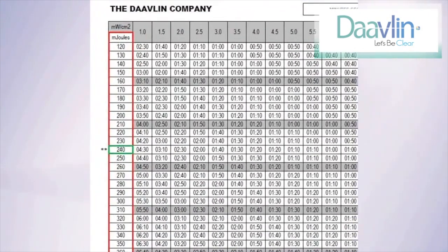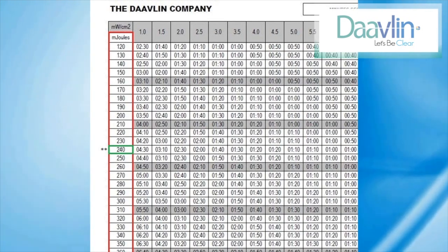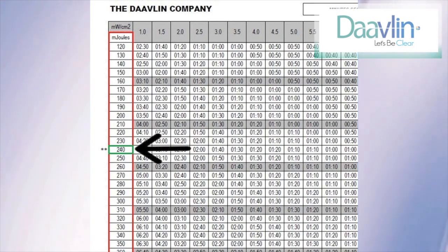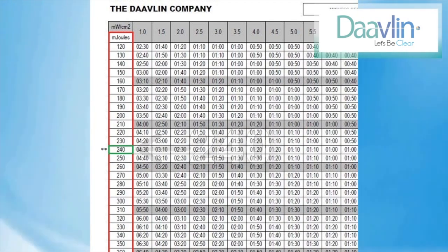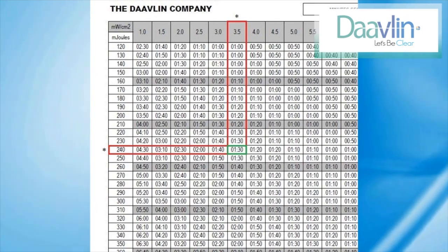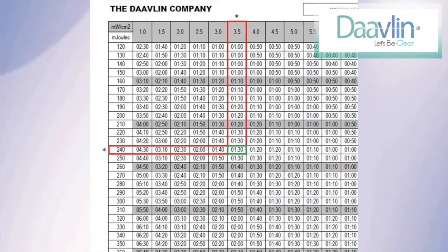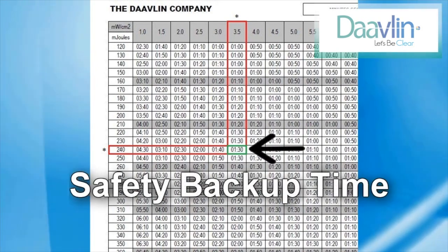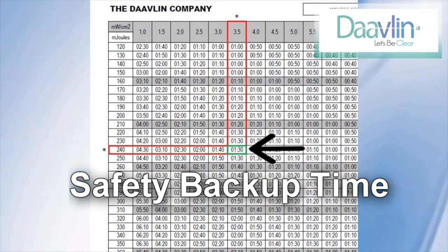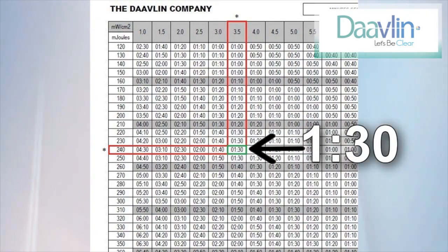Next, look at the column on the far left — here you will find a wide range of potential doses. In our example, the prescribed dose is 240 millijoules, so we look at the column and find 240. To calculate the backup time, we need to find where the power output and the prescribed dosage intersect. This intersection is the safety backup time. In our example, a power output of 3.5 and a dose of 240 intersect at a safety backup time of 1 minute and 30 seconds.